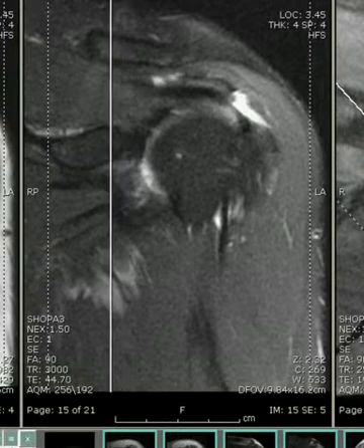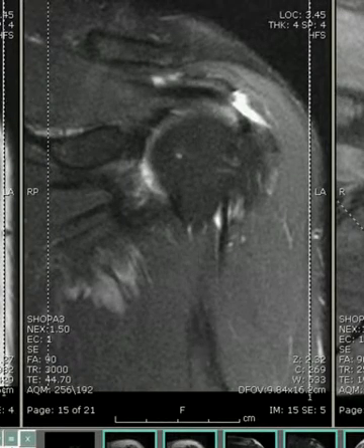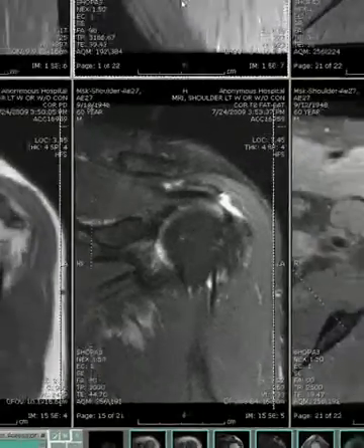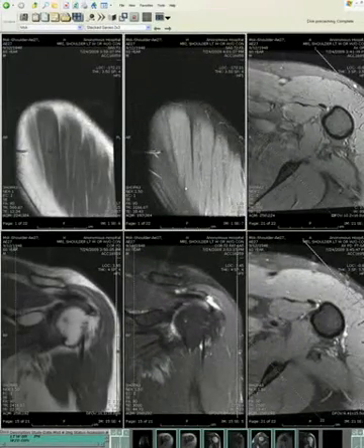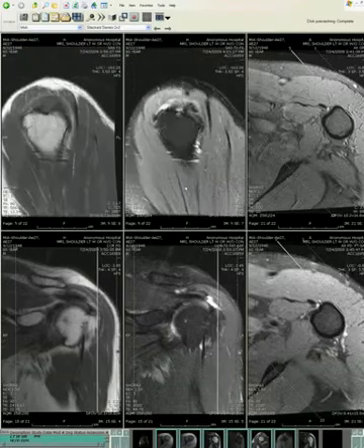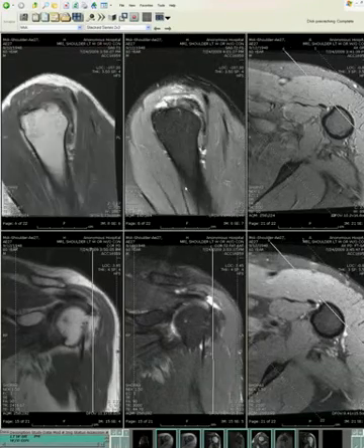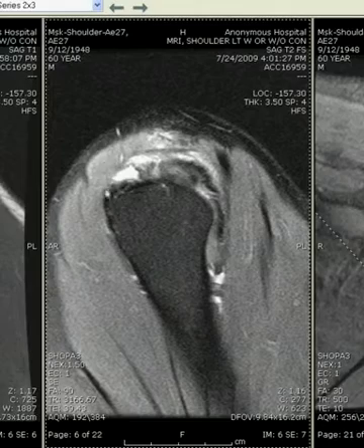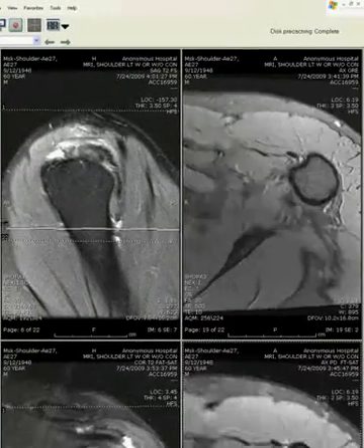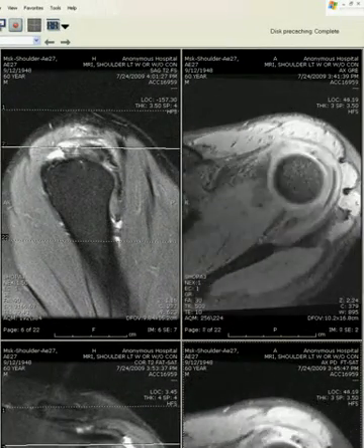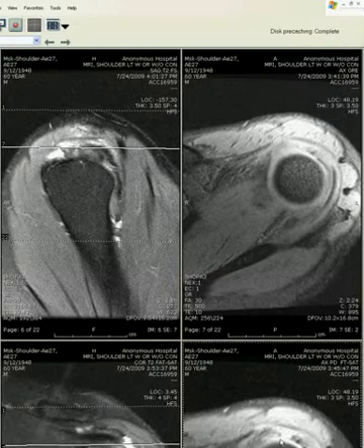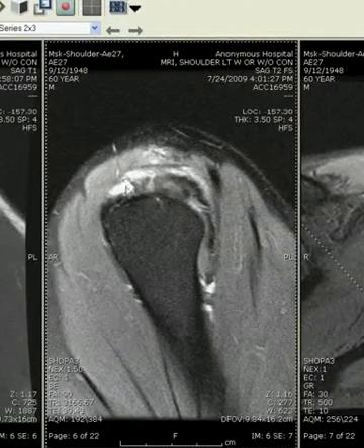As in other joints, we always want to look at abnormalities and normal structures in all planes to confirm our diagnosis. In this case, we can nicely see the focal area of high signal intensity within the anterior portion of the supraspinatus, and we can see this matches the focal area of high signal we saw in the axial images as well.